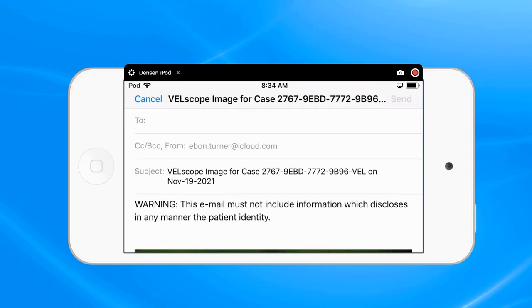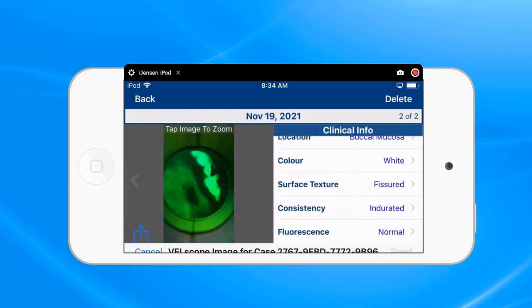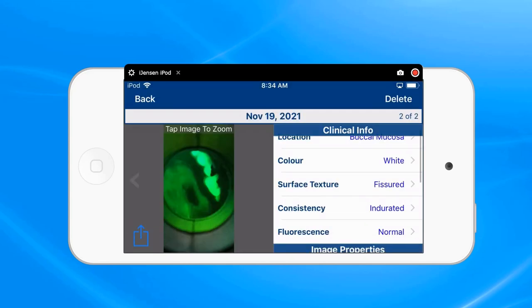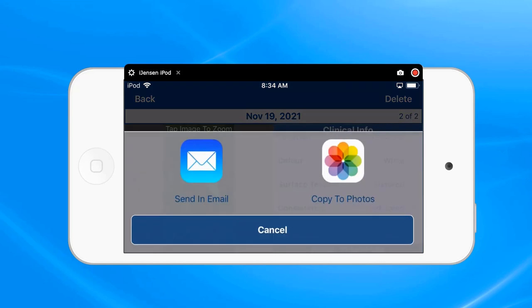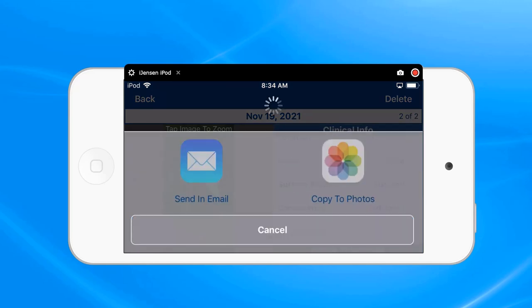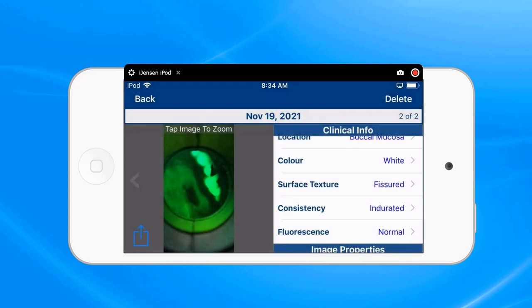The other option is to press the send button and then select Copy to Photos. What this does is take the image from the Velscope app and transfer it into the iPod photos folder, from which we then have to access it.